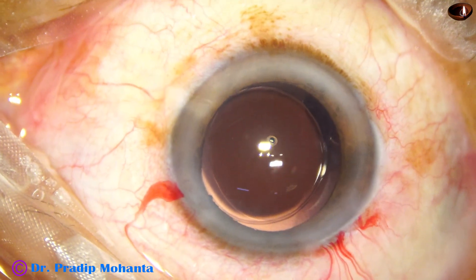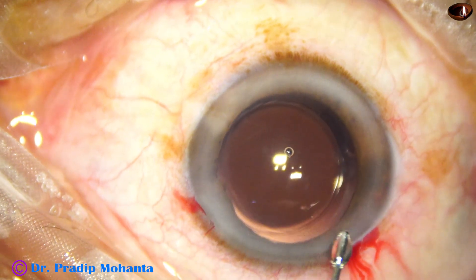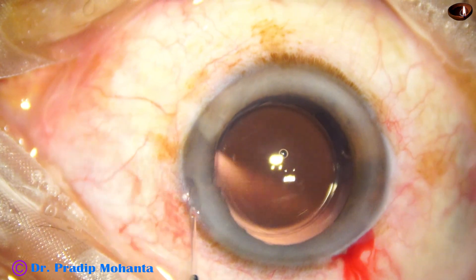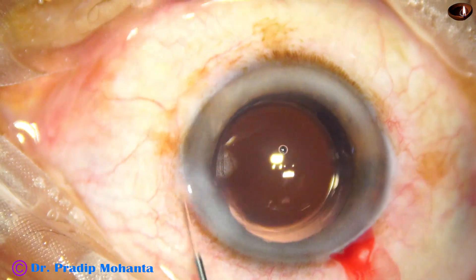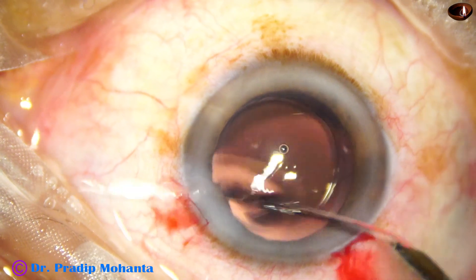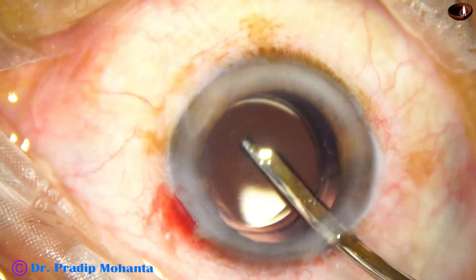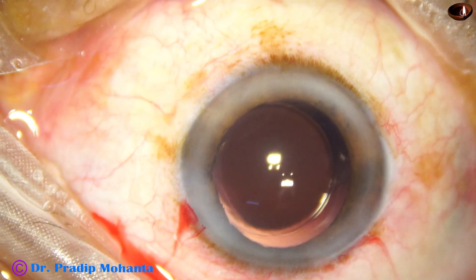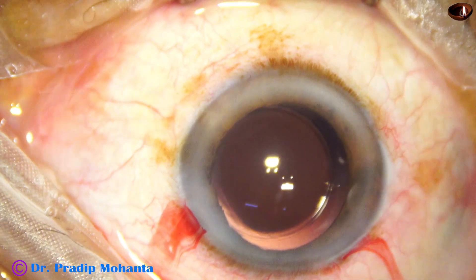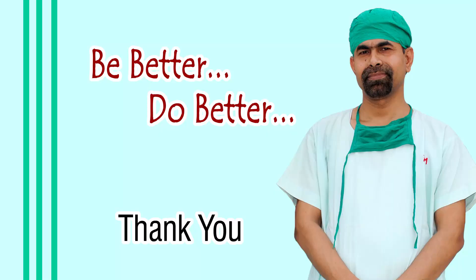The theme of this video is to be safe and at the same time swift. If we save time, we become safe for the corneal endothelium. The side port is closed by corneal stromal hydration. Integrity of the wounds is checked and the case is concluded. Be safe and be swift — thank you very much for your attention.